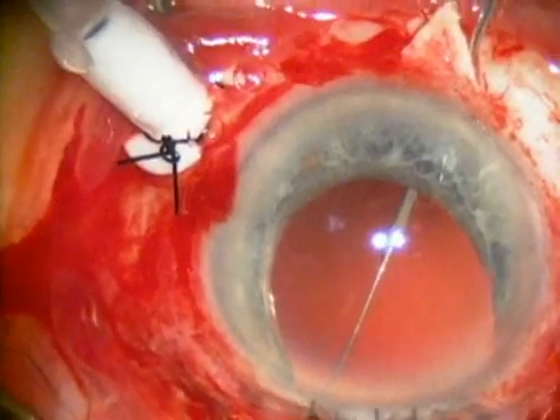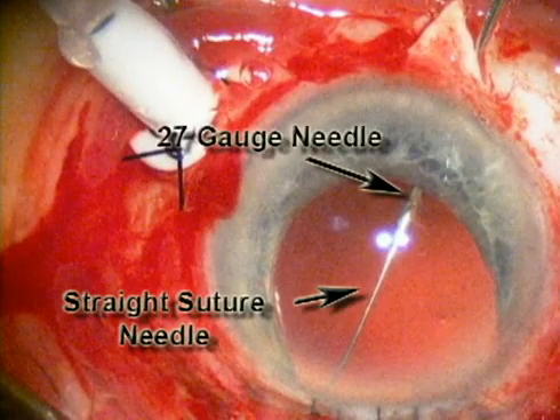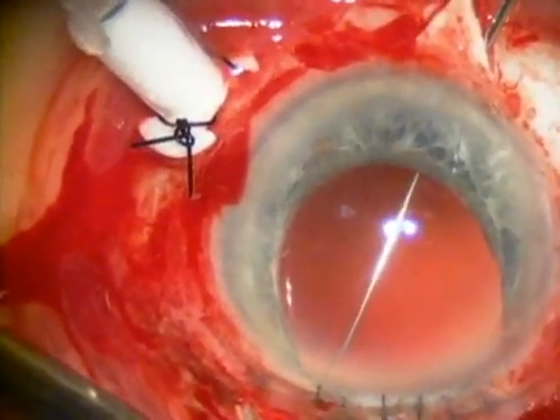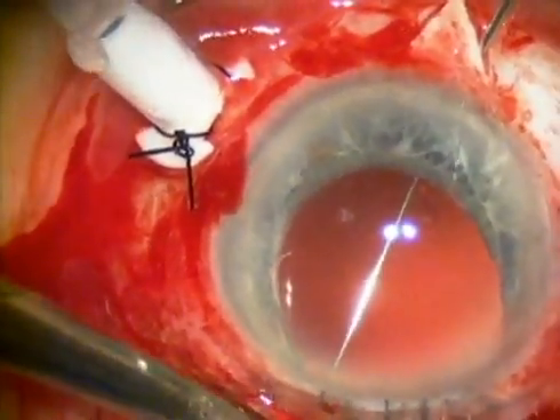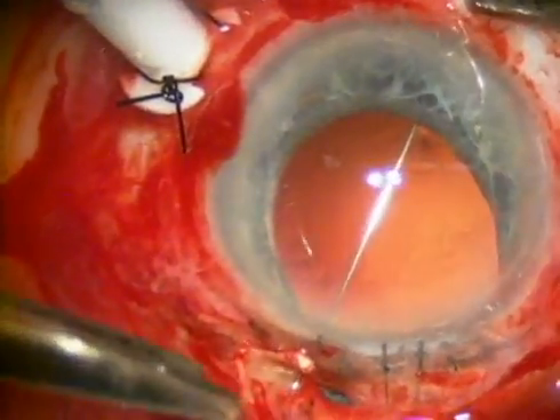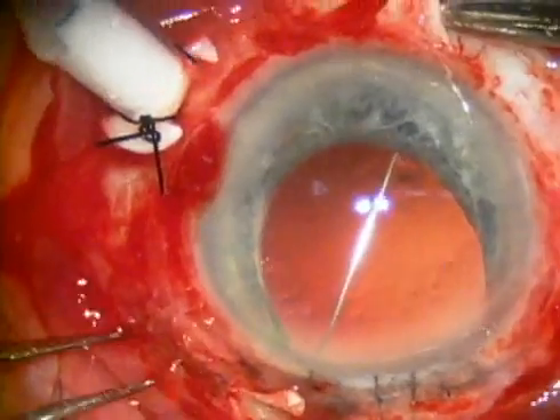By passing the two prolene sutures across the pupil, a little more support is given to the intraocular lens. Also, as you'll see later in the video, by tying a loop around the lens, it is possible to rotate the knots inside of the eye, which helps prevent future exposure of the knots through the scleral flaps.